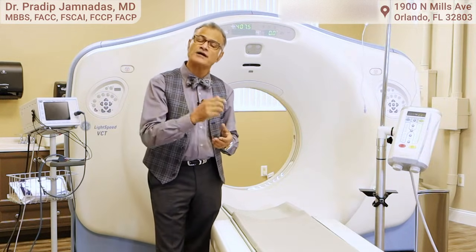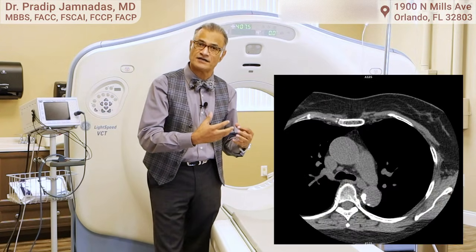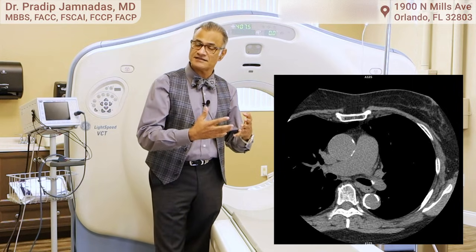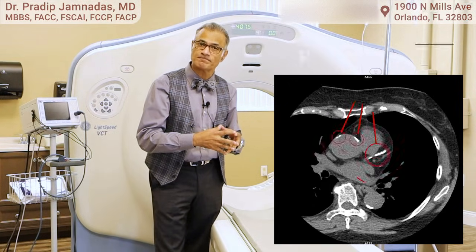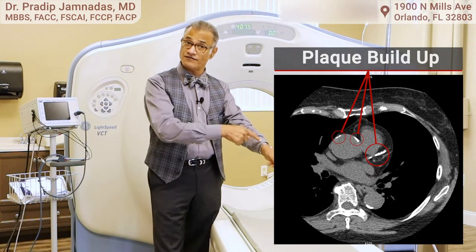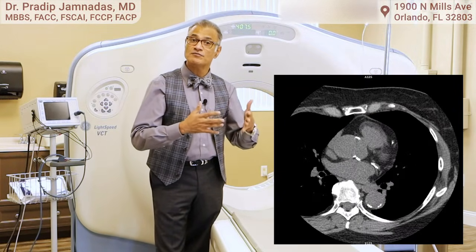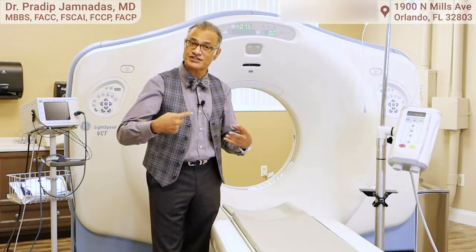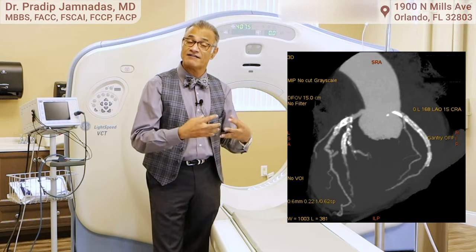A CT scan has two parts to it. In the first part, we look at coronary calcium buildup in the walls of the arteries. That tells us that the patient already has atherosclerosis, because calcium is equivalent to atherosclerosis — the buildup of plaque inside the arteries. The second part is where we inject contrast into the vein, and as the contrast goes through the heart, you can track its movement in the arteries, take a cinegraphic picture, and actually see the circulation inside the arteries.